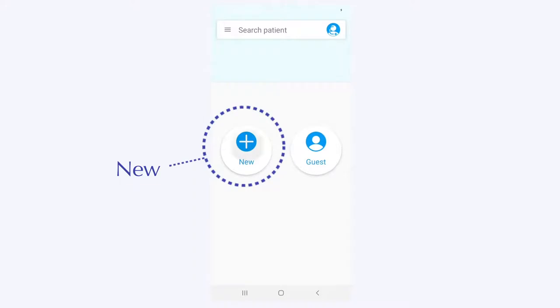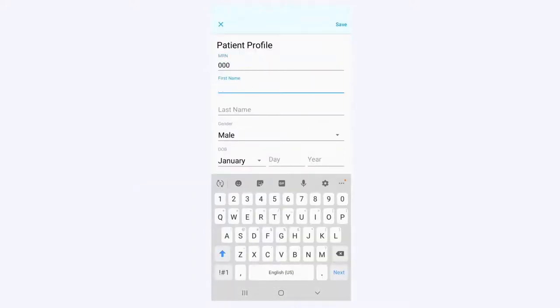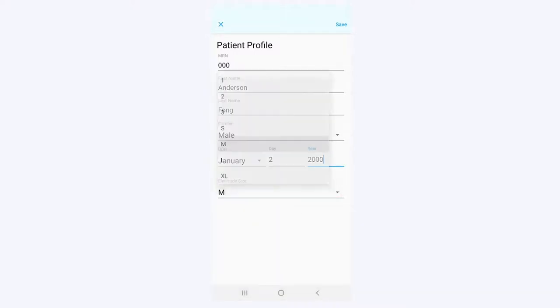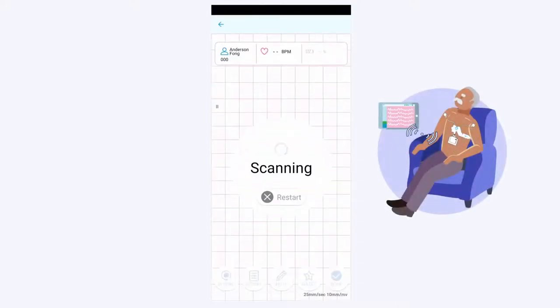Tap the left button, new, and enter your information. MRN may be provided to you on your instructions; if not, type 000. Tap save, sit back, and relax your muscles. The app will automatically connect to the recorder and record an ECG.